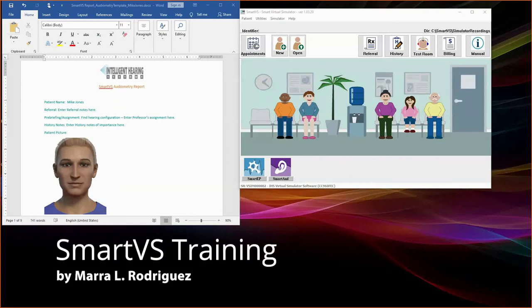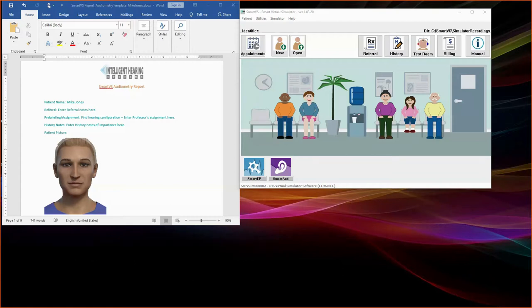Hello, welcome to this training session for SmartVS, Smart Virtual Simulator by Intelligent Hearing Systems. Today I will walk you through performing an otoscope examination, tympanometry, acoustic reflex, audiometry, and speech test using the play patient, Mike Jones.